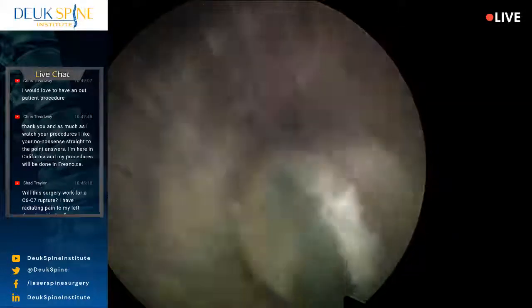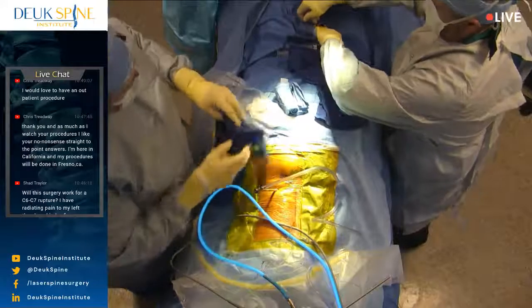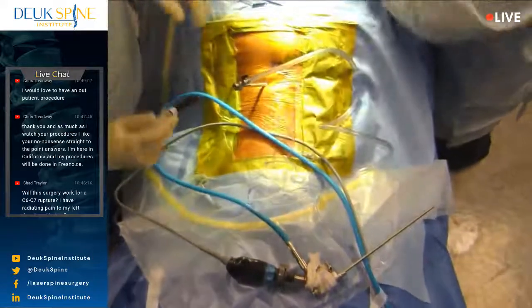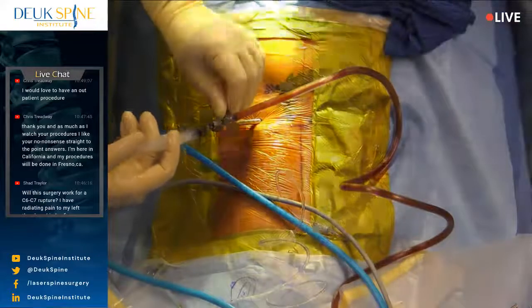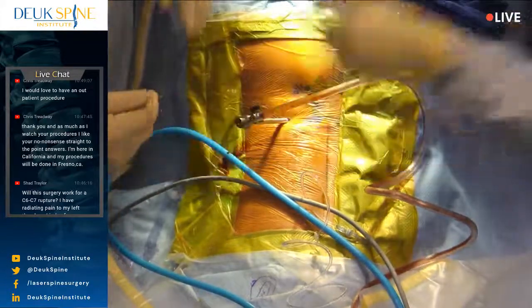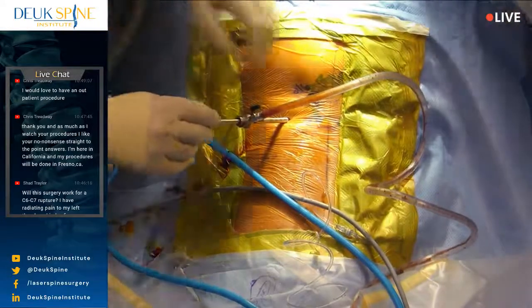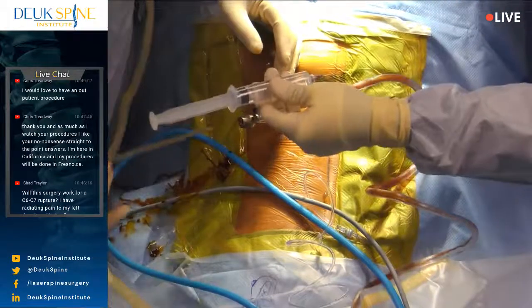Go ahead and type up your questions, and I'll do my best to answer them for you in about 5 minutes. Scope off. Let me show you this incision. There's some disc material. We're just going to put some antiseptic down there. The antiseptic we use is betadine. It's a standard surgical antiseptic.